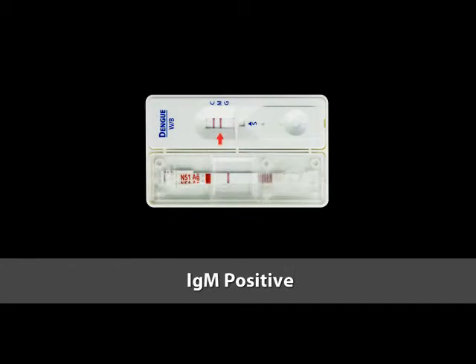Positive IgM antibody to dengue virus would be indicative of a primary dengue infection. Positive IgG antibodies would be indicative of secondary or past dengue infection. Positive for both IgM and IgG antibodies would be indicative of a late primary or early secondary dengue infection.